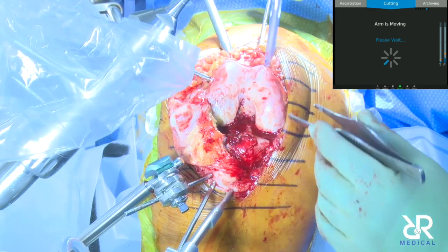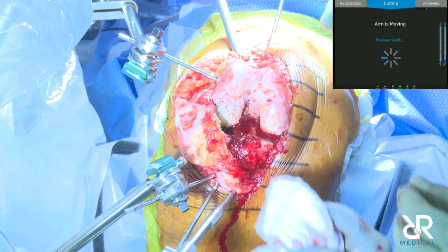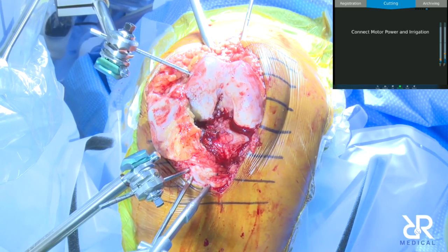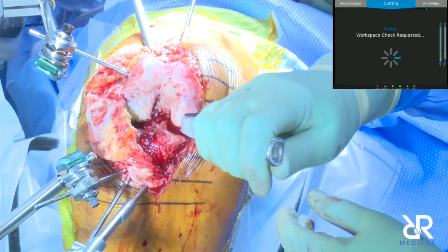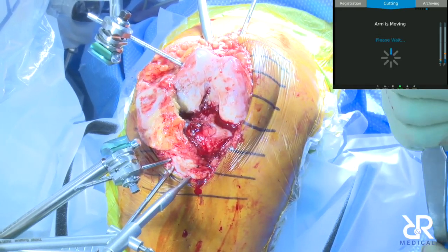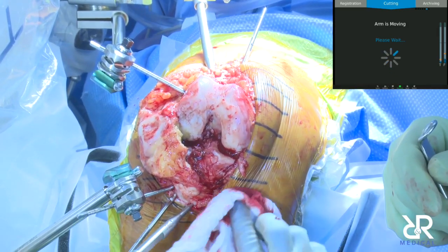It's really not an issue if you lock it in nice. We've not had many aborts. We've had some aborts because of the hard bone, because in the surgery center we do young males, and sometimes their bone is so darn hard that it shakes. And we had a hard time cutting through the bone. But even that is not an issue. We just have to slow down the robot.